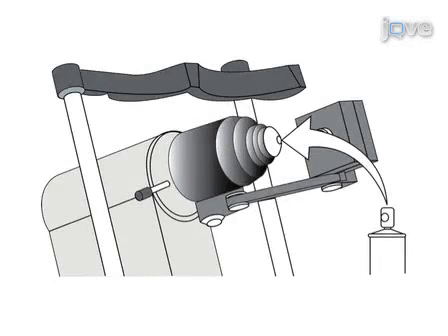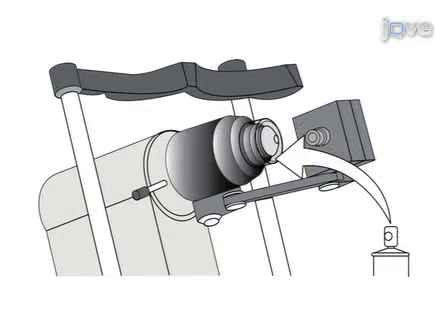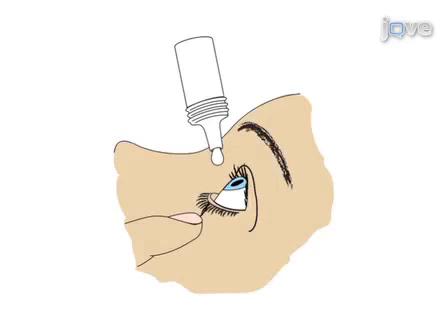First, the focal plane of the lens on the CCM is adjusted and visco-tear gel is applied to the lens before fitting the disposable cap. Anesthetic drops and visco-tear gel are then applied to the eye.